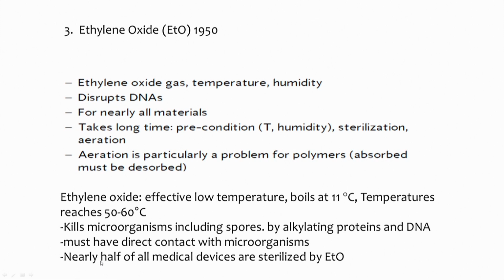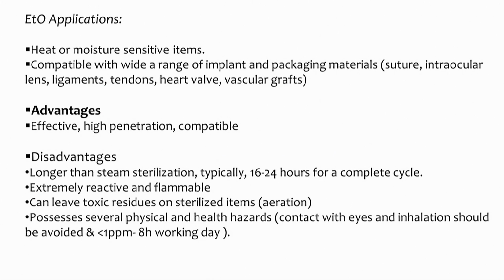This is very widely used; half the medical devices are sterilized using ethylene oxide. Heat or moisture sensitive material can be done with this, compatible with a wide range of implant materials, packaging materials, sutures, intraocular lenses, ligaments, tendons, heart valves, vascular grafts.